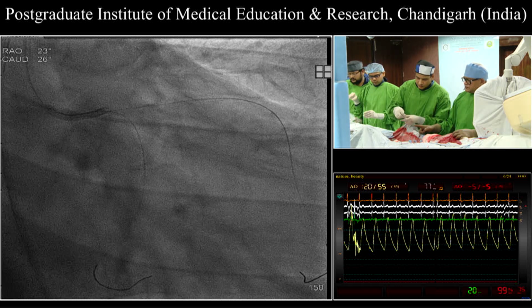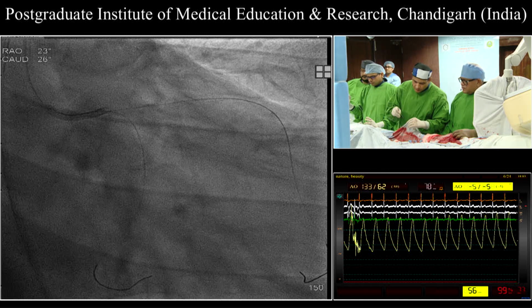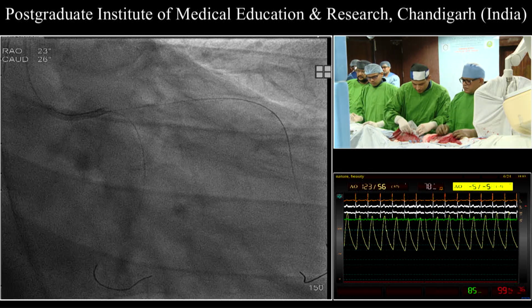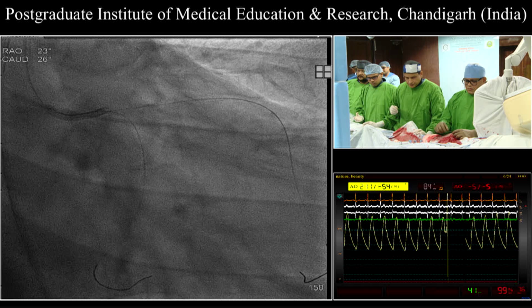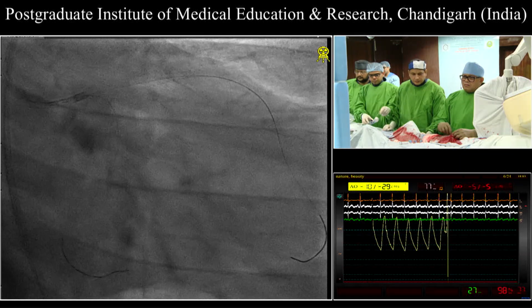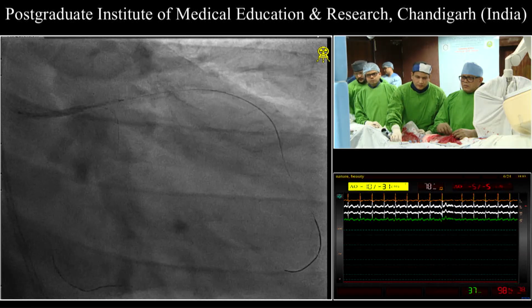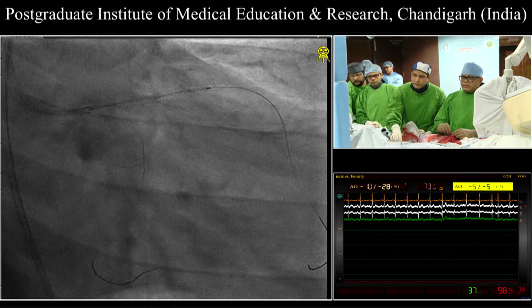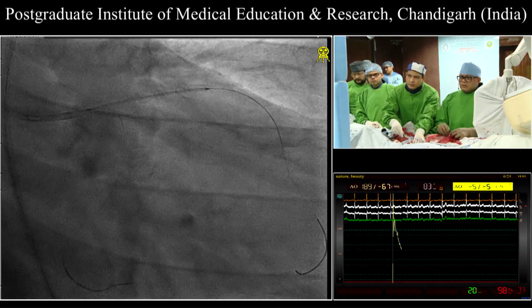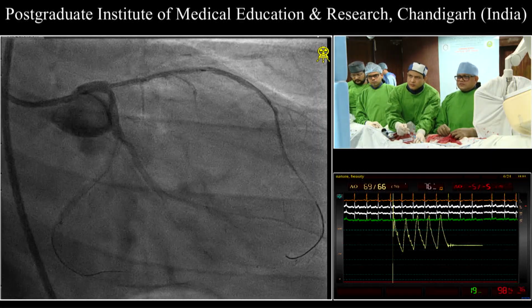One of the risks if you stent the distal part is that, if it is not re-dilated, you also need to prepare this part. I don't think you need to stent this part, as it's definitely not flow-limiting. You will not get an edge with a high risk of edge dissection, because you only have fibrotic tissue and the old stent with restenosis. The edges are the most important predictor of edge restenosis, so I think it's safe to have the stent end in the middle, and you can cover the lesions that you have already pre-dilated.